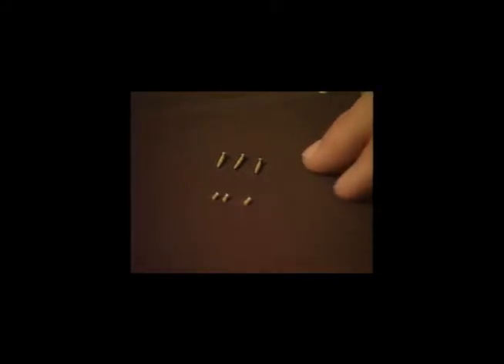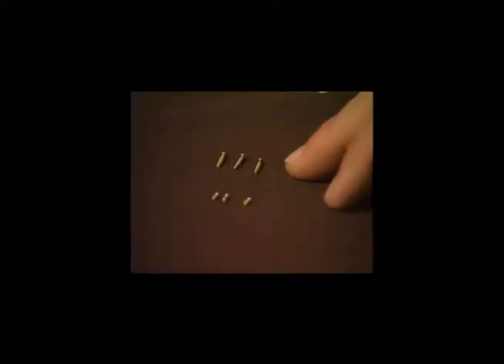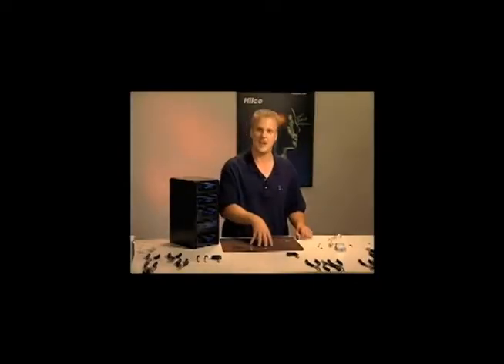Above that we have repair screws. These are self-tapping stainless steel screws, and primarily they're used when the hardware in the frame is damaged, whether you've drilled out the frame or the customer maybe stepped on the frame and the screw was ripped out and damaged the hardware. You would use a repair screw, and really the only critical dimension on that screw is the diameter. You tap it in, the excess screw comes out the bottom of the hardware and you snap off the excess. There's no need to worry about the length of the screw. Both those types, replacement and repair screws, are included in the system, and it's a good idea to have at least some of these two types of screws on hand.